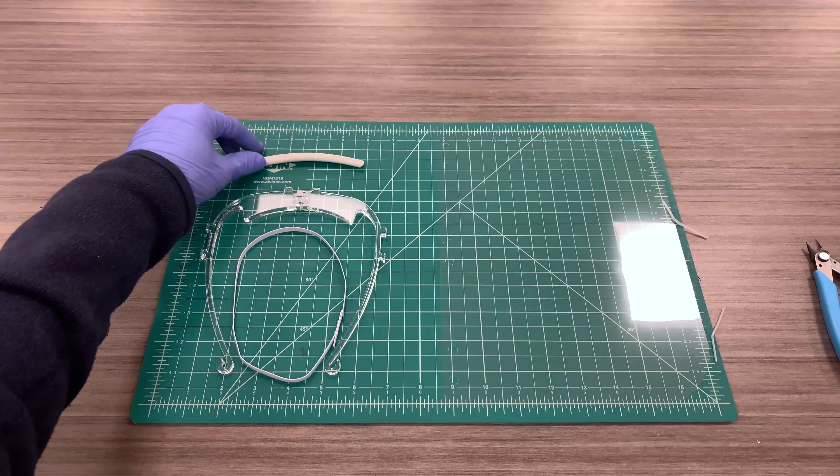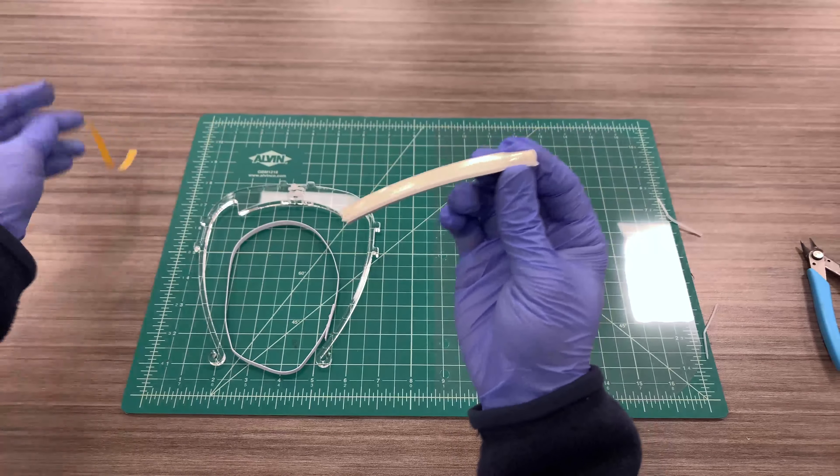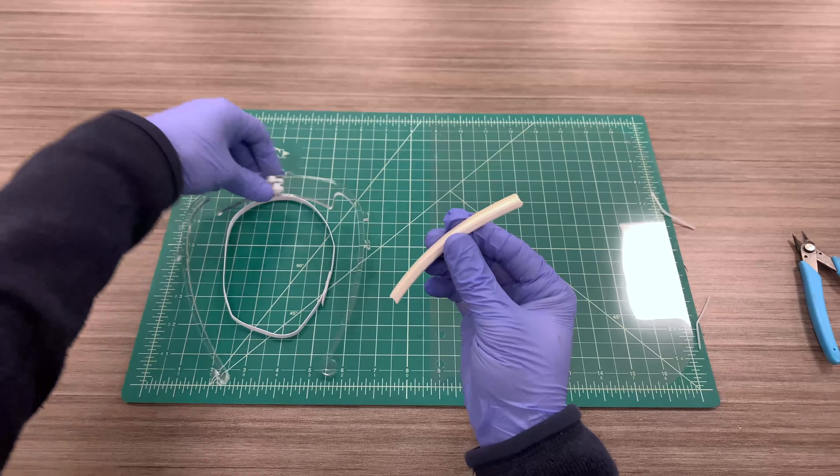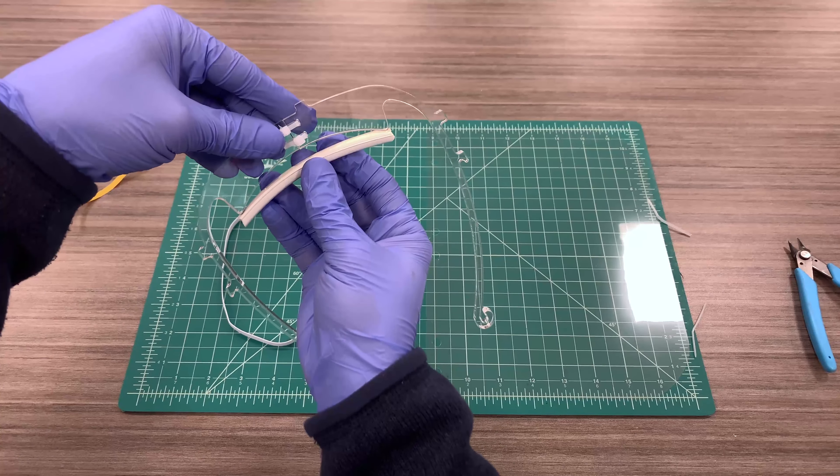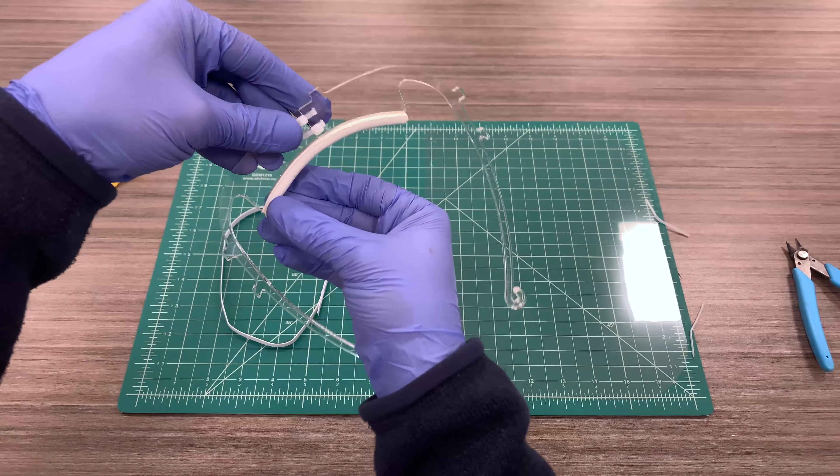So now we're going to attach the rubber. It's weatherstripping. You peel the sticker off. You line it up as best you can to the center, and just press in and make sure it sticks throughout.